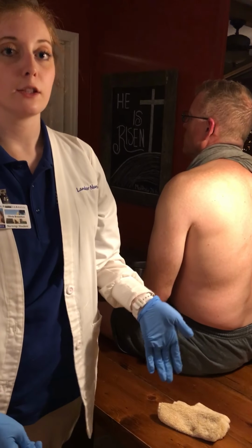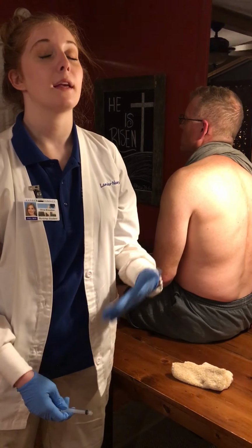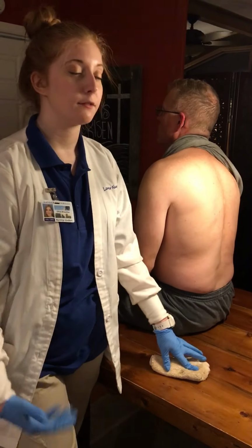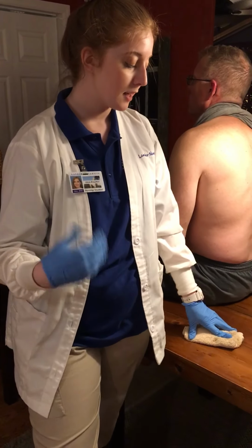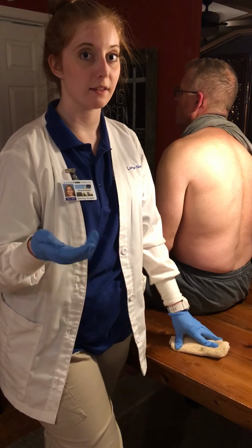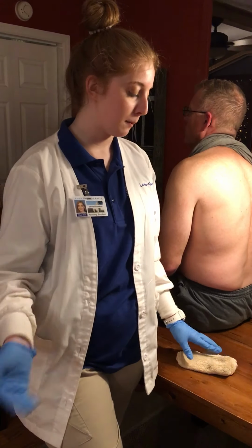But if I was doing a Z-track, I would wait 10 seconds before withdrawing the needle, but once I withdraw the needle, I would immediately release the skin. I'm going to apply gentle pressure, watching for bleeding, and then I'm going to make sure that the safety mechanism is in place on the needle, and then I would dispose of that in the appropriate sharps container.